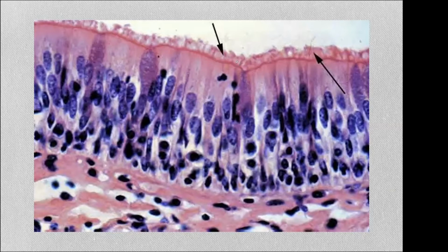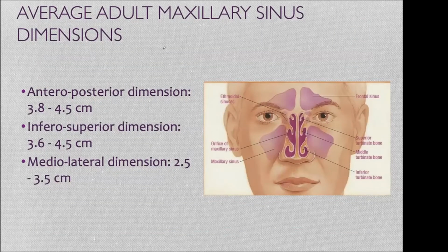If we protect this and preserve this, they will help fix our mistakes. If, on the other hand, we cause significant perforations and tears, introduce foreign objects, and do not protect the patients, we can get an infection or the weight of fluids, from retained mucus to pus or other fluids. That can cause a mechanical pressure on the implants as well as other organic pressure such as infective. Okay. The dimensions of the sinus are not as important to us when we're talking about internal sinus lifts, but they are important in case you're considering lateral lifts. Every case is different, and obviously there are ranges of approximately a centimeter, a variation in width and height, et cetera, et cetera.